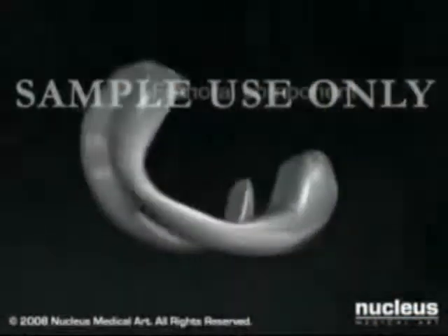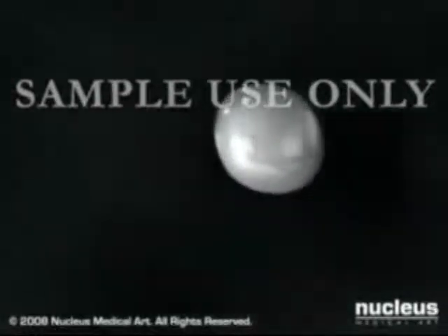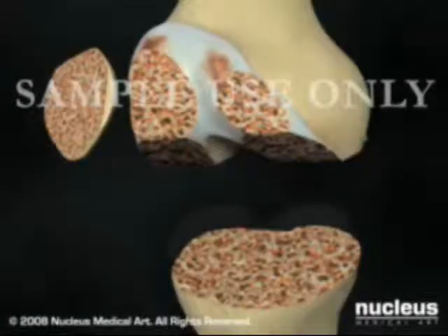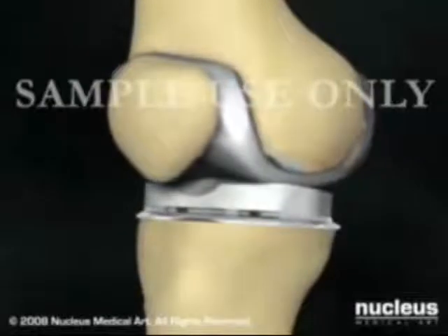The new prosthetic knee generally consists of a femoral, a tibial, and a patellar component. Once the ends of the bones are prepared, your surgeon will cement the new prostheses into position.